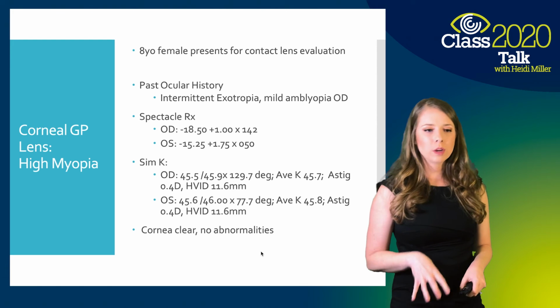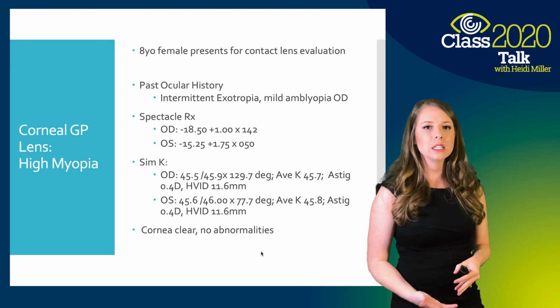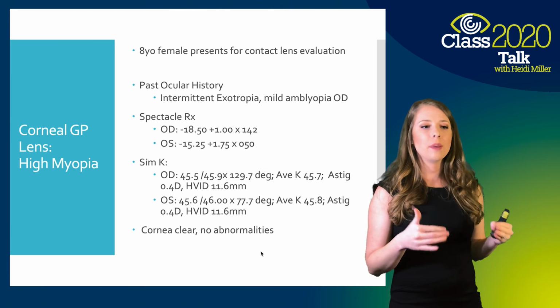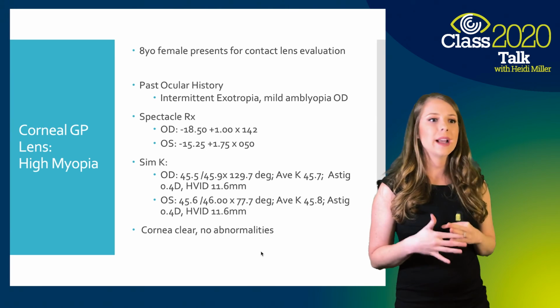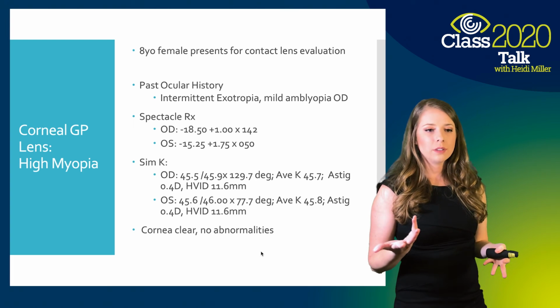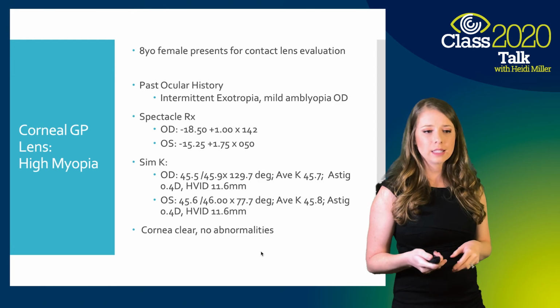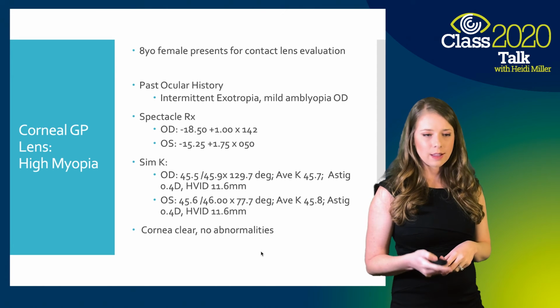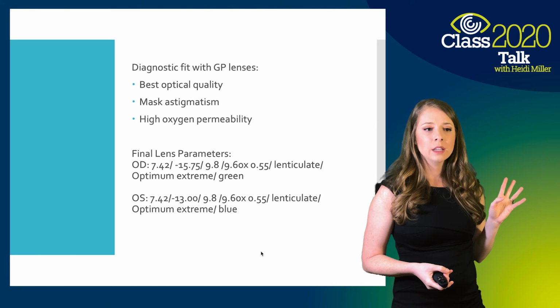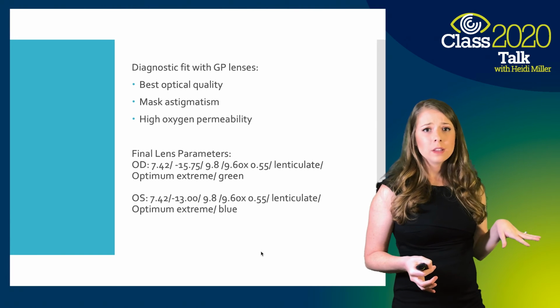Because of her prescription and because of the astigmatism, I thought the best option for her oxygen-wise, vision-wise would be a GP. So we talked about that. Based off of her case, I selected some lenses, threw some diagnostic lenses on, and I felt that at that initial visit, she was seen pretty well.